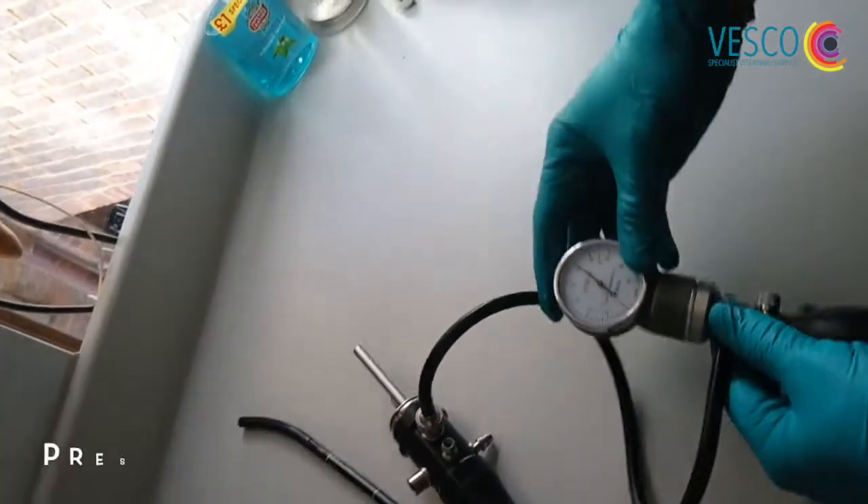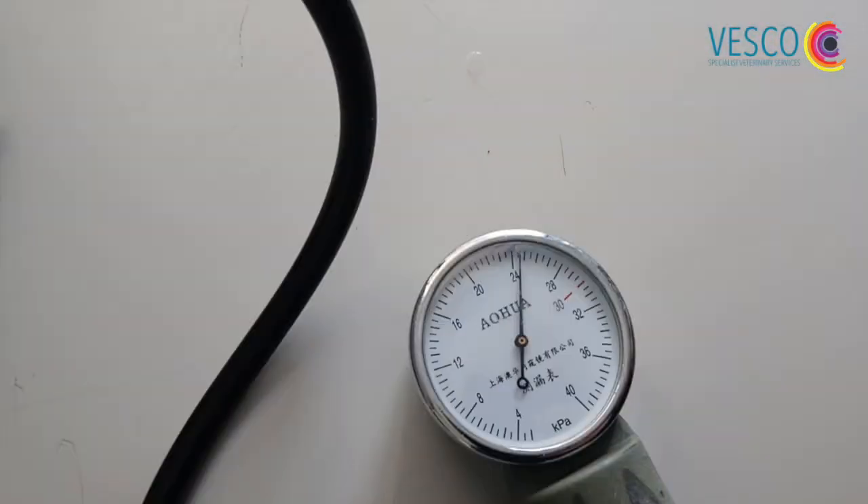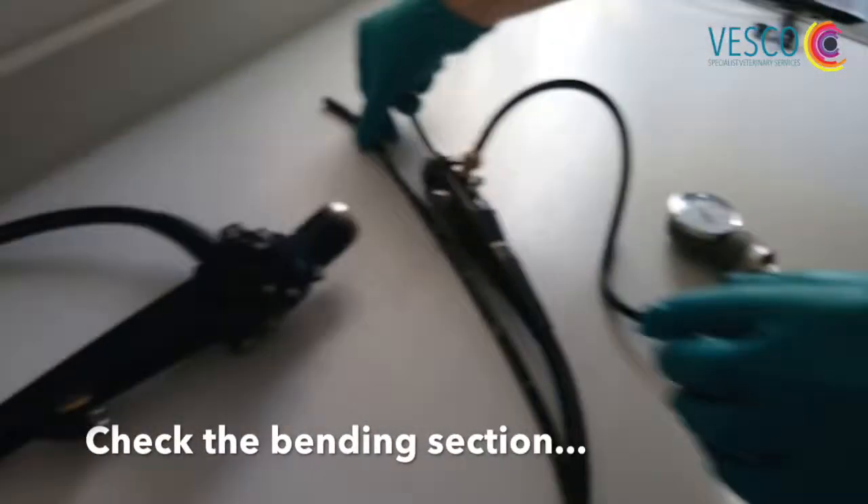First thing I'm going to do is pressure check it before I submerge it. You can see that the pressure is stable. Just check the bending section to make sure I don't cause any loss in pressure. Just check the angulation controls.